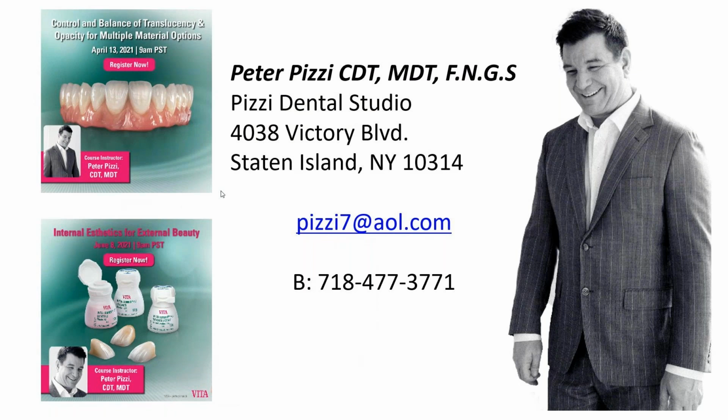The best example I can give you, let's say you're doing an 8 and 9. The 8 has a post and core, and it's really dark. Well, if the doctor takes an impression of those two, you have to start really thinking through what material can I use to mask that really instantaneously and still create the depth. It's kind of a silly concept, so we do the opposite.